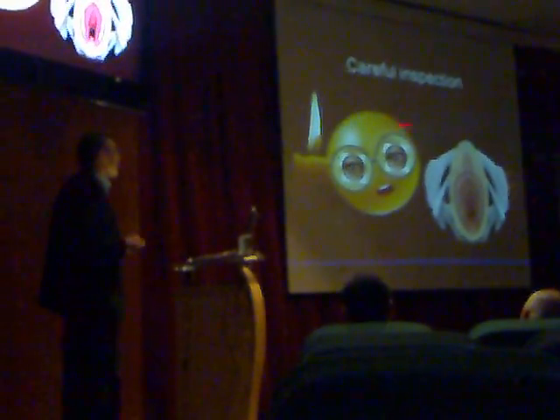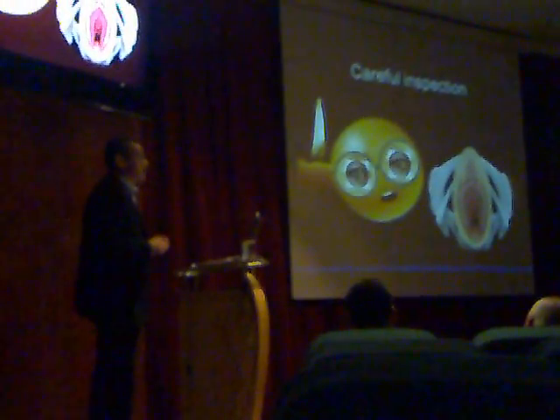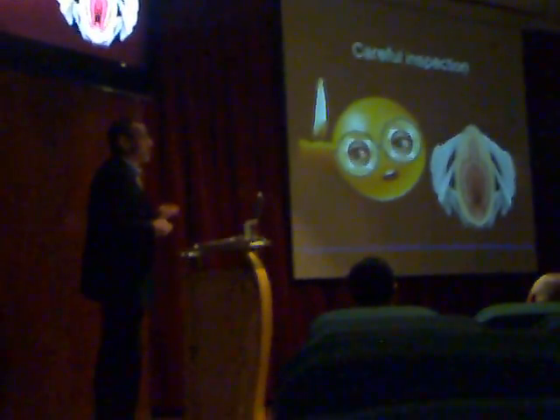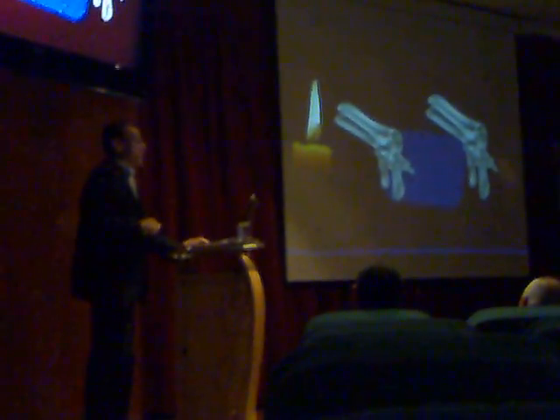Very important. Careful inspection of the vulva, vagina, perianal area, and cervix. Why? For any abnormality in addition to human papillomavirus, there can be additional findings. Start with your eyes. The second, introduce the speculum.